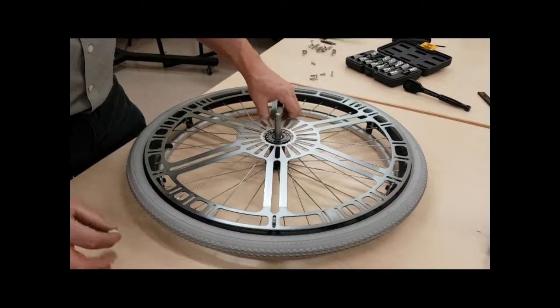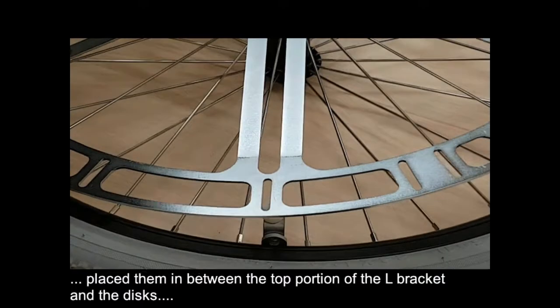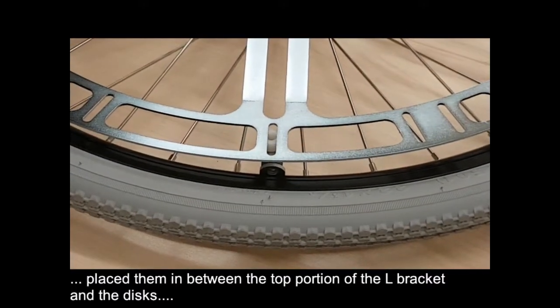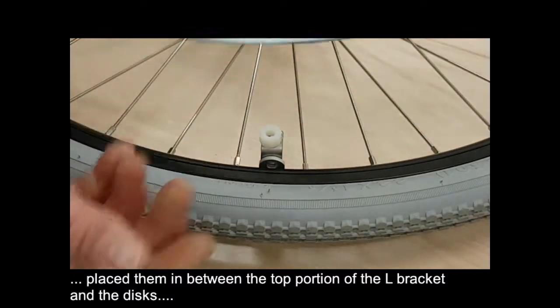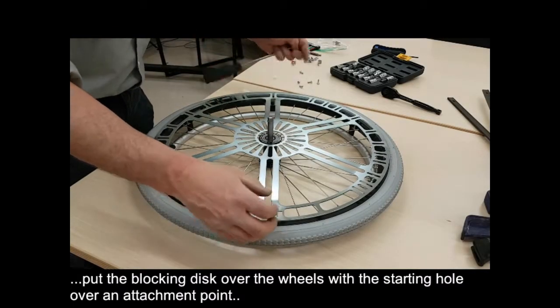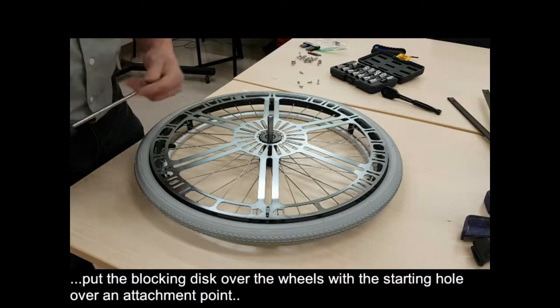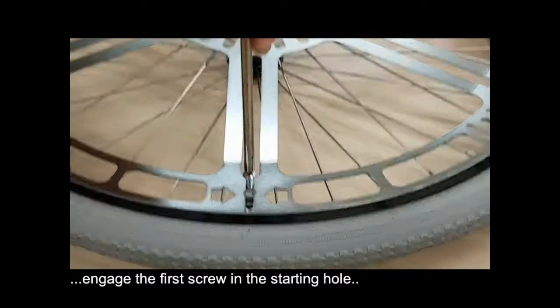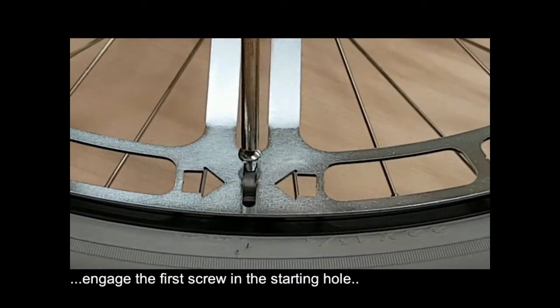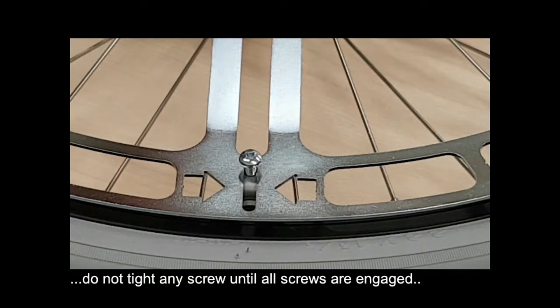If you ever have to use the spacers, then you put the spacers in place and then you put back the blocking disc in place. So the spacer is really in between the attachment bracket and the blocking disc outside rim. As we said previously, we put the blocking disc in place, always starting with the hole identified with the 2 arrows. Then using the screws that are supplied, we put in place the first screw and repeat with the opposite screw.